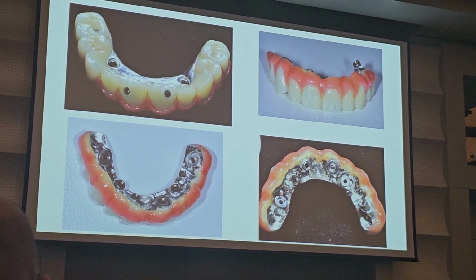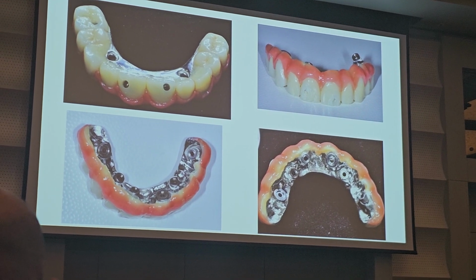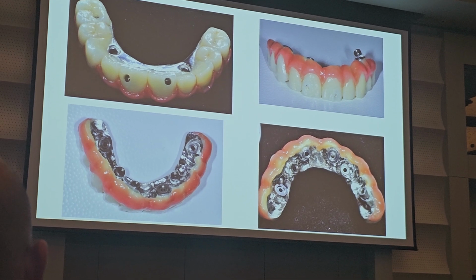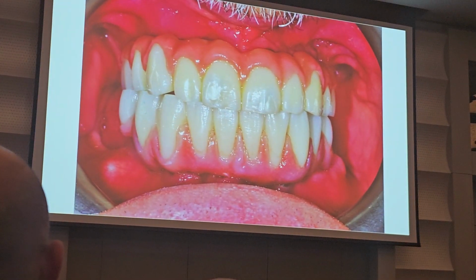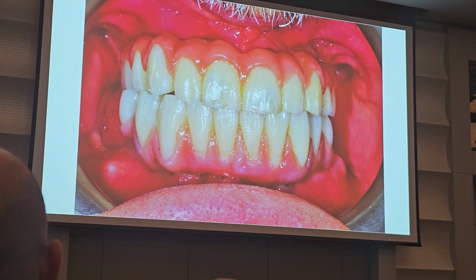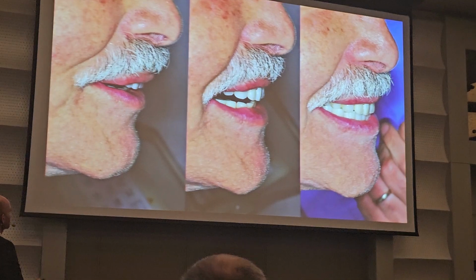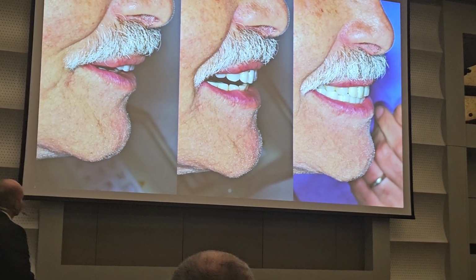Anyway, I didn't notice the problem because you don't know what you don't know. At the time, I didn't know. Look at the hole on the buccal side. Anyway, the cosmetic result was not bad. Not Chu John style, but you know, a patient of 72, 73 years old. Okay, these teeth, it's enough.